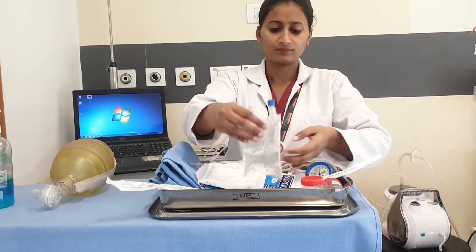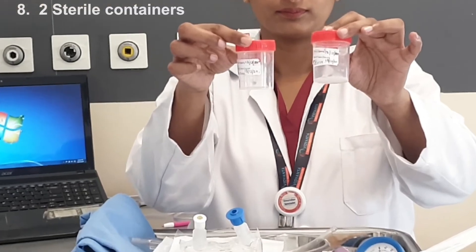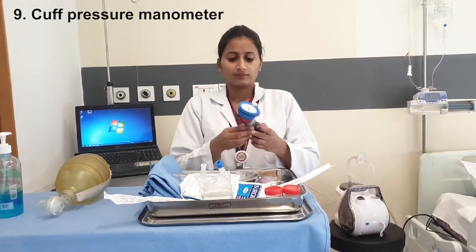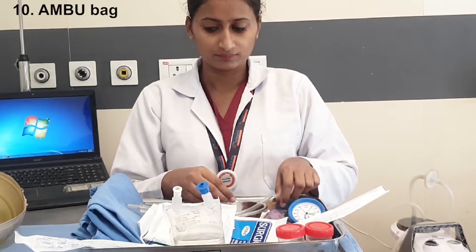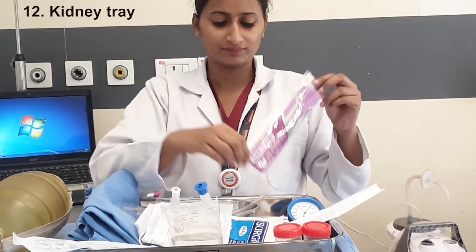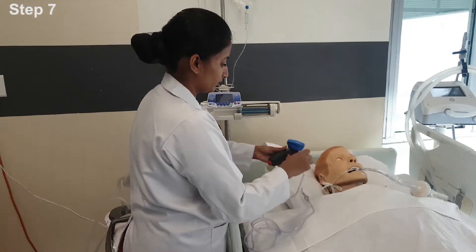Eighth: two sterile containers — one for ET flush and the other for oral flush. Label the containers with date of opening and date of discard. Ninth: cuff pressure manometer — check the cuff pressure. Tenth: ambu bag for pre-oxygenation. Eleventh: 20 ml syringe. Twelfth: kidney tray.